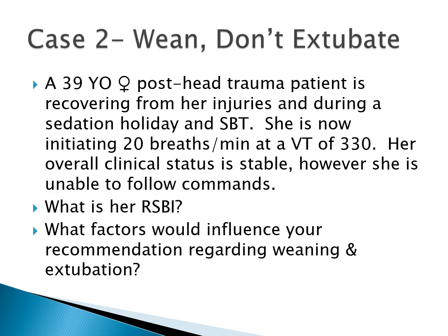This case 2: wean, don't extubate. So we have a 39-year-old female post head trauma, recovering from her injuries during a sedation holiday and spontaneous breathing trial. She's now initiating 20 breaths per minute at a tidal volume of 330. And again, I didn't give you her parameters, but they seem really respectable.